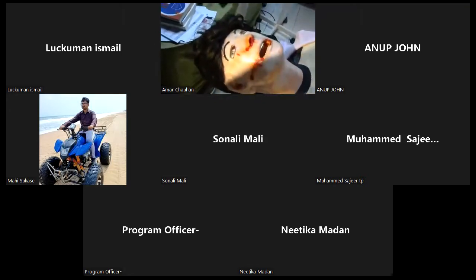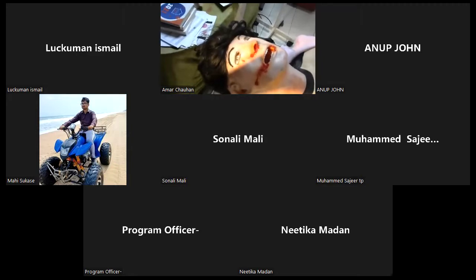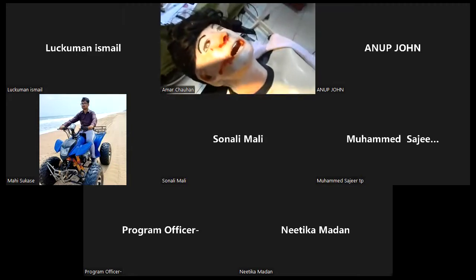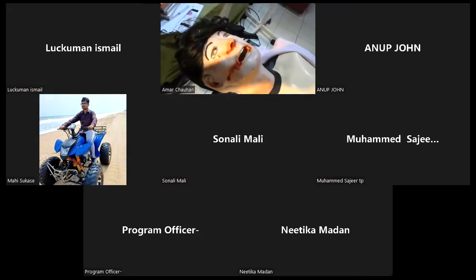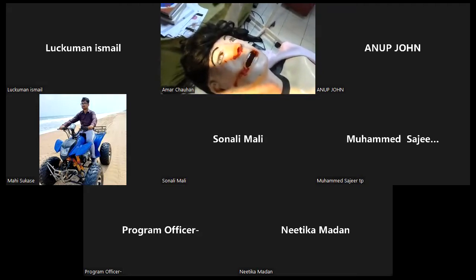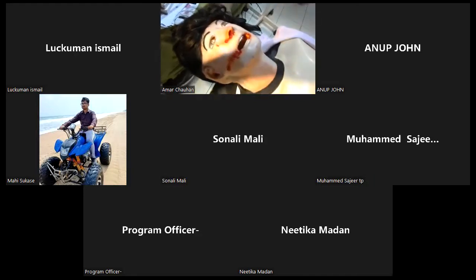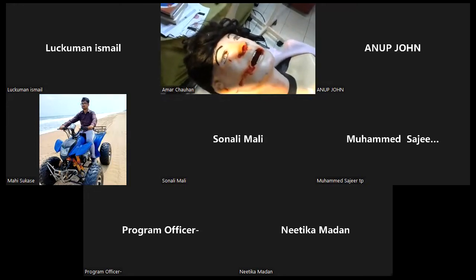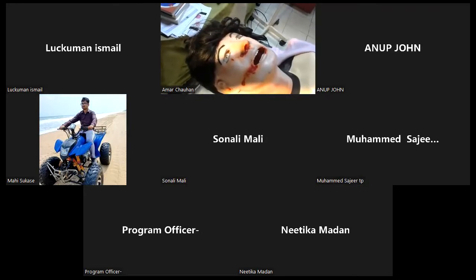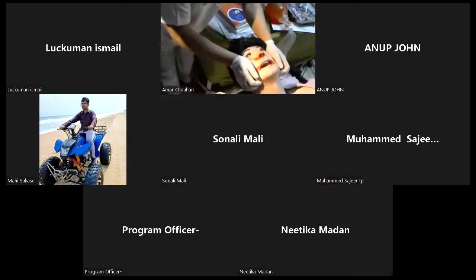The patient is in altered sensorium, he is not breathing properly, and in such a patient, what we need to teach our candidate is that his airway is obstructed. Can you see the mannequin, Lukman, clearly? We are able to see the mannequin, sir. Okay. So when a patient comes with altered sensorium with this kind of breathing, that is, the airway is compromised, we need to do a jaw thrust. So I will just demonstrate a jaw thrust.